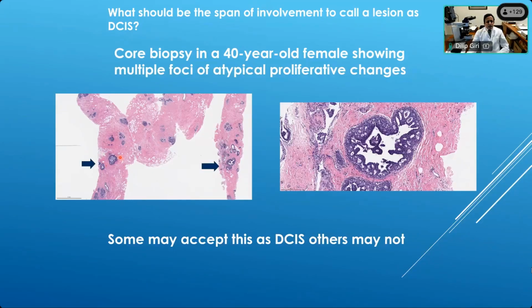Okay, here it is. So this is a core biopsy which is showing atypical ductal proliferation, and you can see that this is another core showing similar change. Now, how do you measure the size here, right? So on core biopsies, unless you have a core with many atypical ducts lined up and involved, in that case you could measure, but here you can't measure. This could be more than 2 millimeters, less than 2 millimeters. So you would end up calling something like this in different ways, right? ADH cannot rule out DCIS. Some may even call it DCIS, depending on their index for atypia.